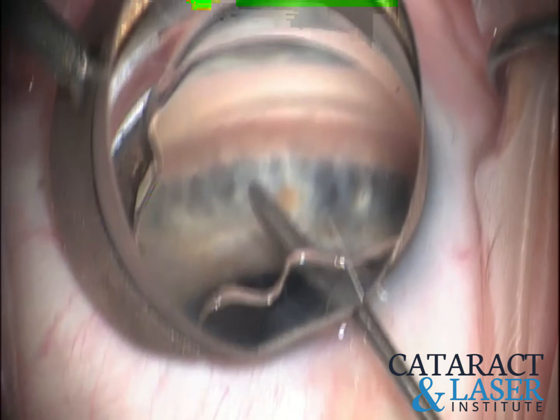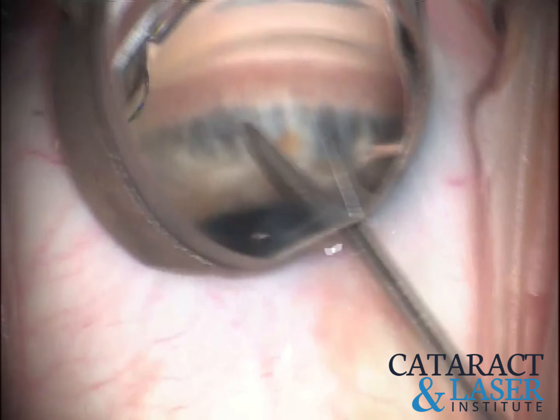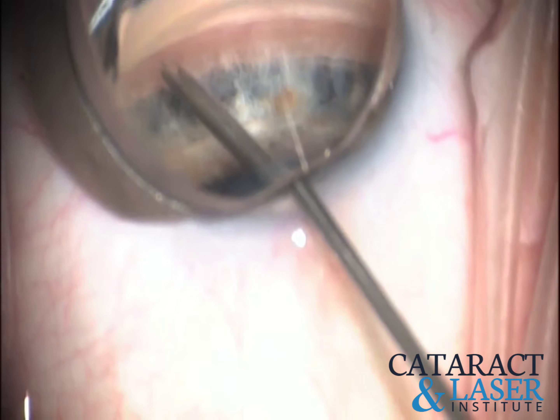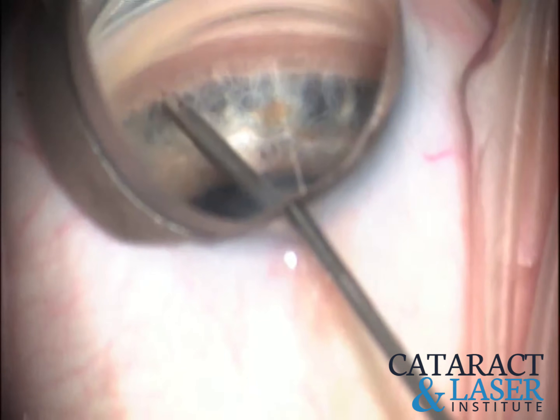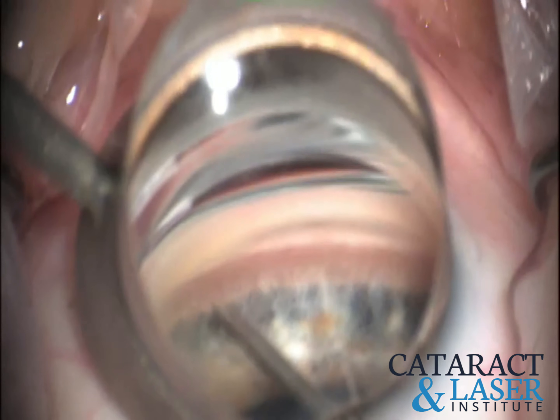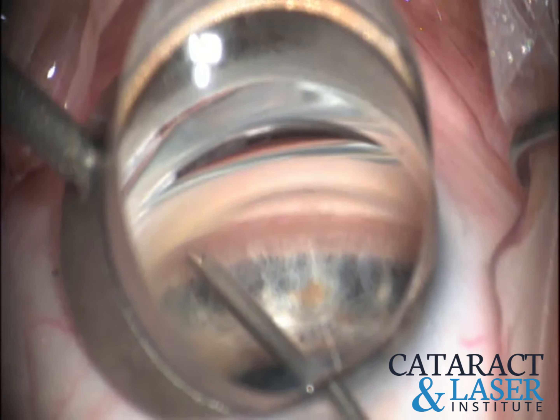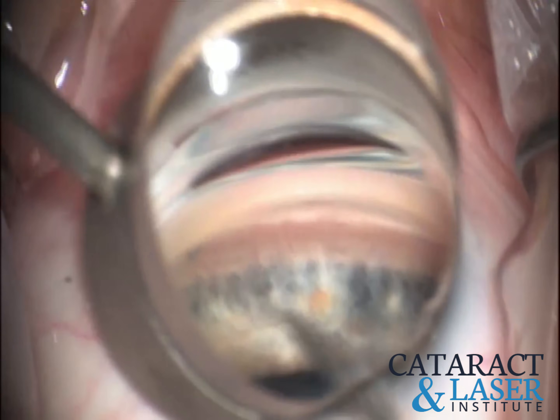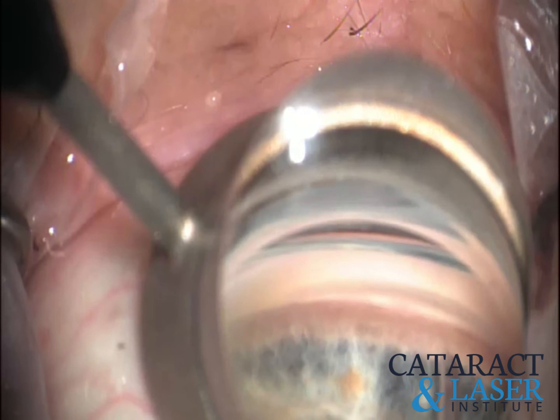Here, sadly, I'm going to be a little out of focus for the first inject, but this one goes in nicely without any real complications. We're sliding back the injector tip, finding a nice pigmented section of trabecular meshwork, and slipping that little needle tip just gently against the trabecular meshwork. You don't have to push as hard with the inject wide as you do with the classical inject.